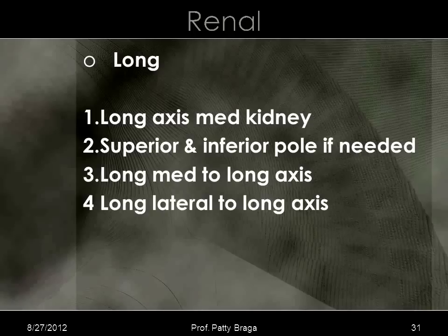A lot of times we don't do that, and you'll see a lot of sonographers scanning and not have the patient take in a deep breath. Well, part of it is as you get more experience, it's much easier to scan between the ribs and get the pictures that you want. As beginning sonographers, it's not going to be as easy for you.